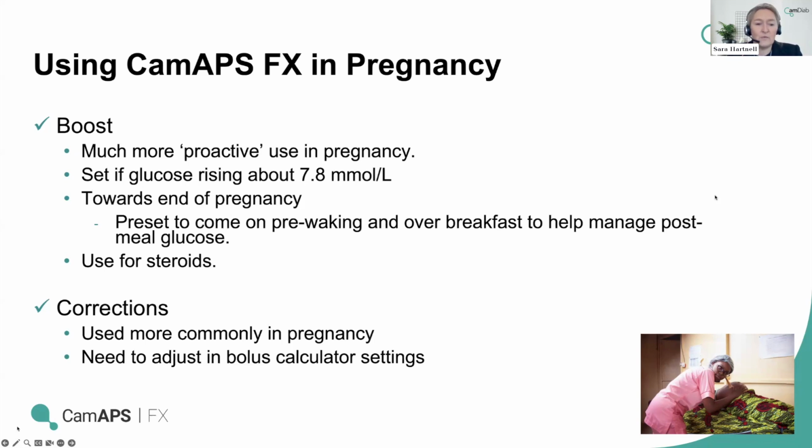And then obviously corrections are more commonly used. Women are encouraged to be really proactive. And that's when those bolus calculator settings come into play. So in the same way as you're adjusting the carb ratios and the basal settings as insulin requirements increase, don't forget to adjust the sensitivity as well.